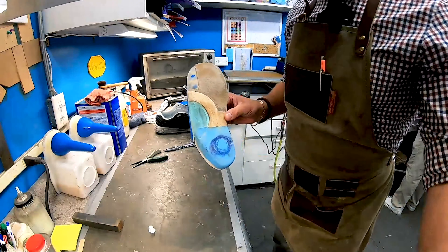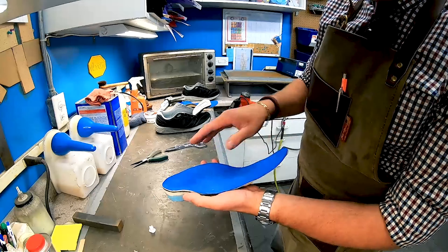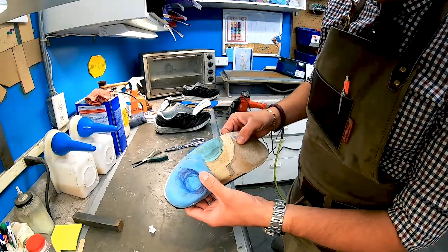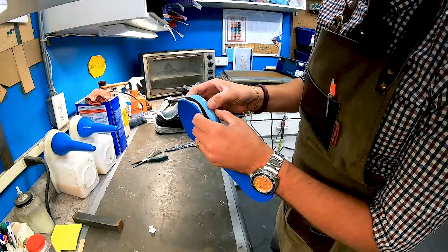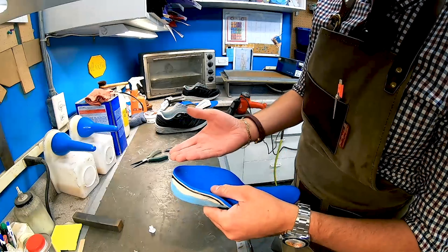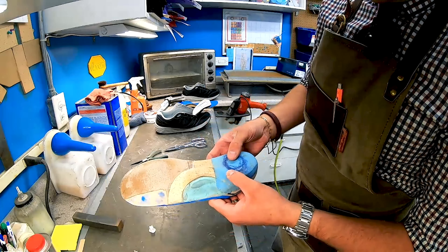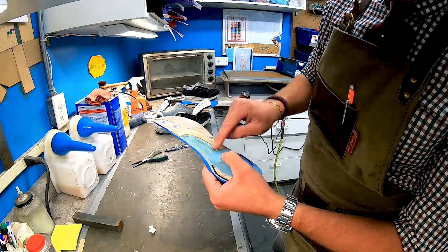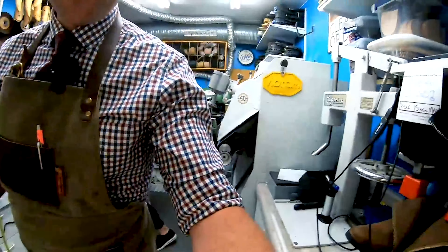Now I want to do a quick cleanup on the orthotic. Cleaned it off with acetone, heated it up to bring up the EVA. Just touching the heel — we have extra PORON, an extra quarter of an inch elevating the heel to help offload as much as possible without over-elevating. We're going to fill this area in with a new layer of SR PORON.